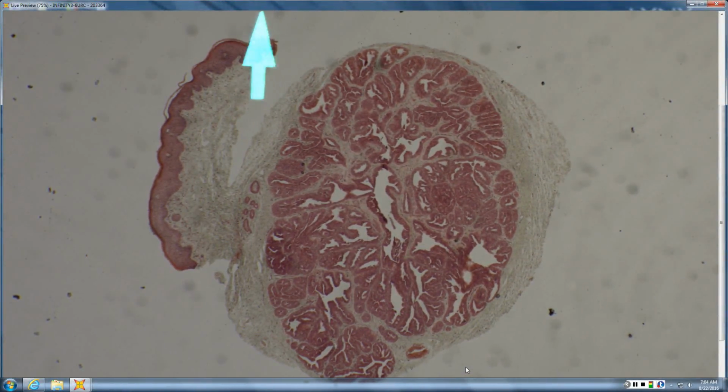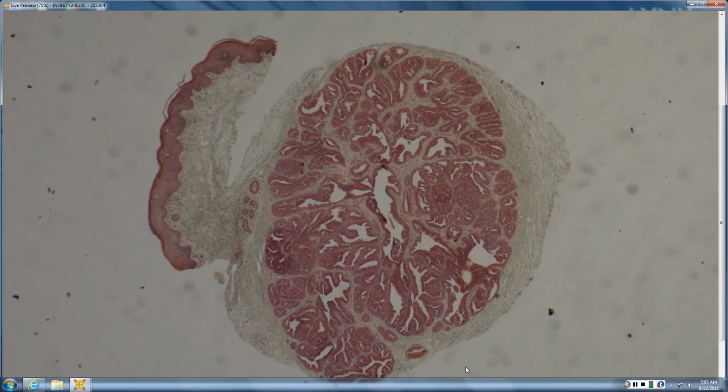It is in the skin, and it's just a very well circumscribed lesion. And again, these are usually in hidden locations. So maybe in the history you'd say, "Oh, it's from the vulva or something, or the axilla, somewhere like that."